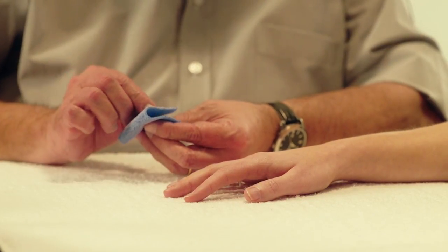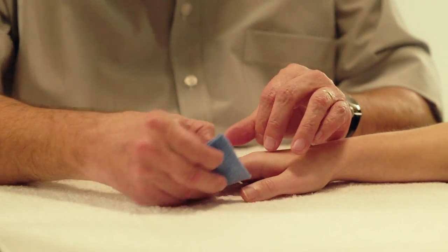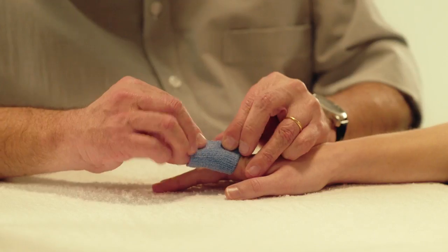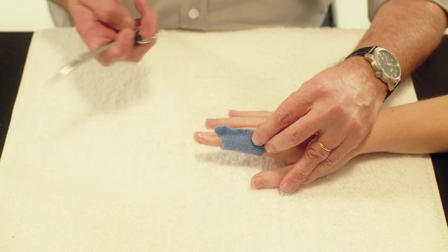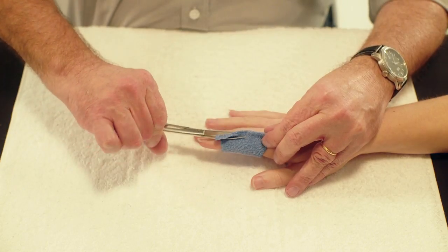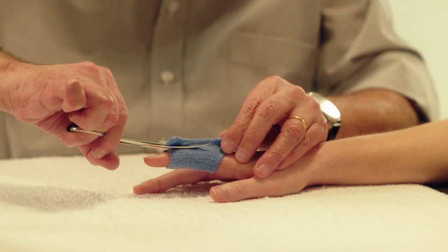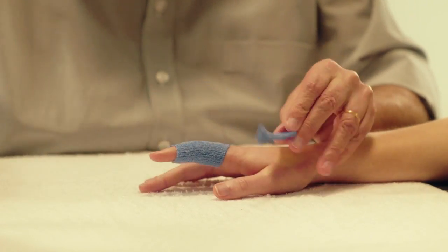Heat the 6 cm Orficast and fold it in half lengthwise. Pass the material under the palmar side of the proximal and middle phalanges and pinch it together on the dorsal side. Immediately cut the material with curved scissors as close to the skin as possible. To avoid cutting the patient's skin, pull the material up and away from the patient while cutting.